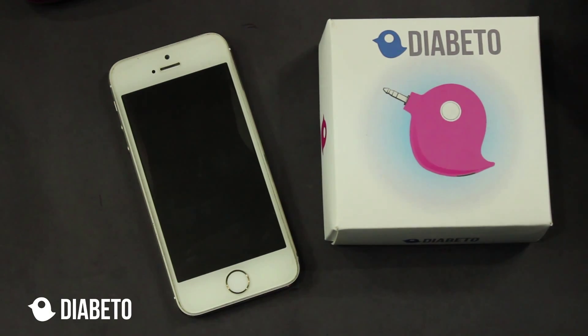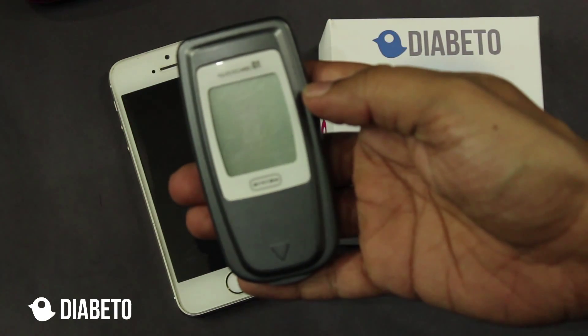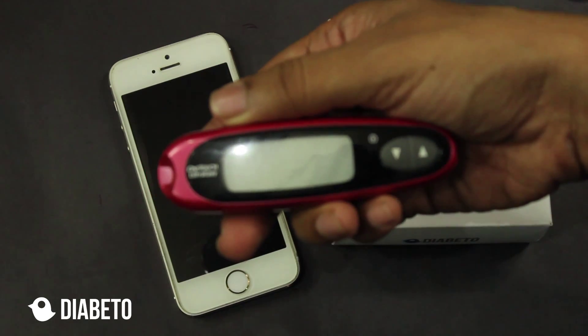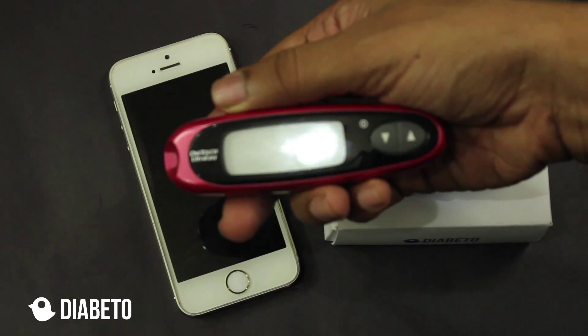For demonstration purposes, I'm going to show two glucometers. One is Glucocard 01 by Akre and second is OneTouch Ultra Easy, and in some countries it's called OneTouch Ultra Mini.